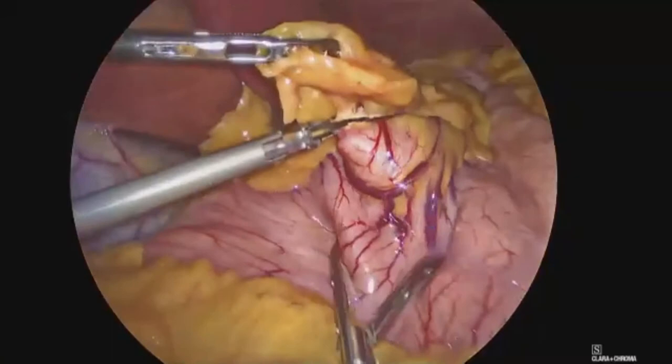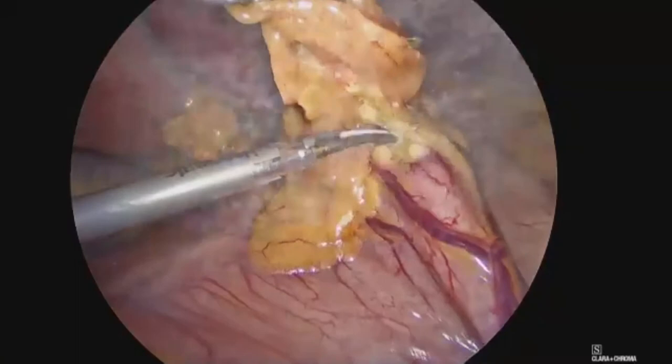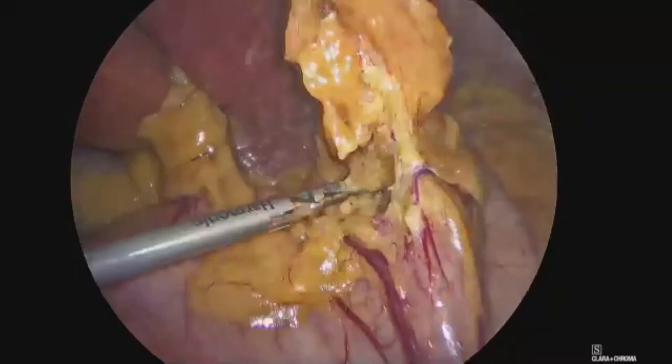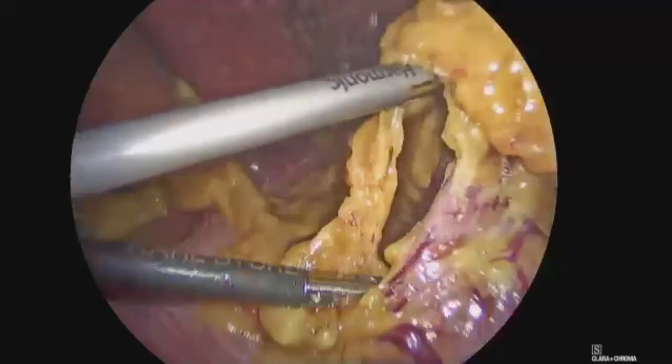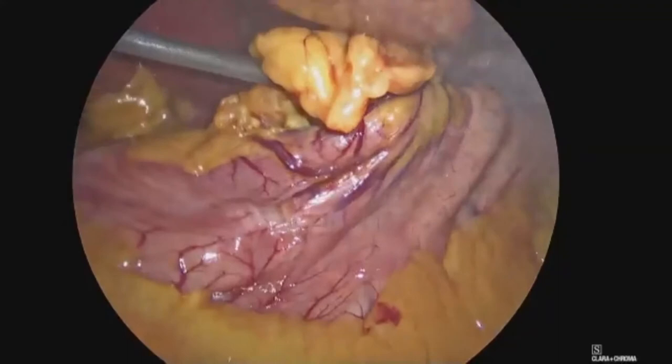This is the area of the crow's feet. We're going to go here, make a space to enter into the lesser sac. One anastomosis is a shorter procedure because it's just one anastomosis, so we usually would not have to do a lot of dissection close to the G junction. You can see I've entered into the lesser sac. I take a stapler, and the first one I fire usually is a gold.